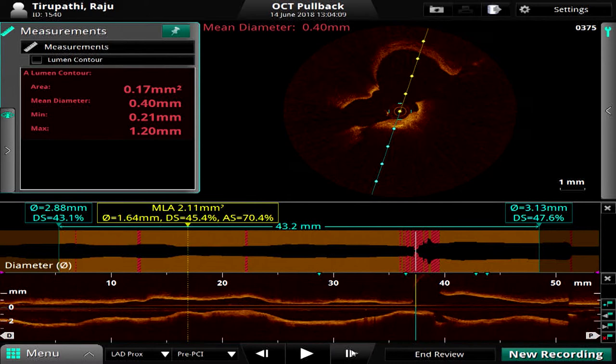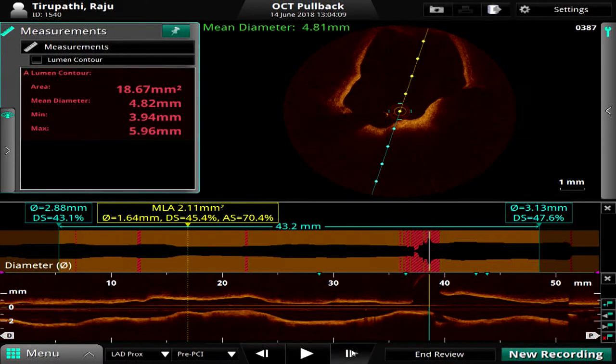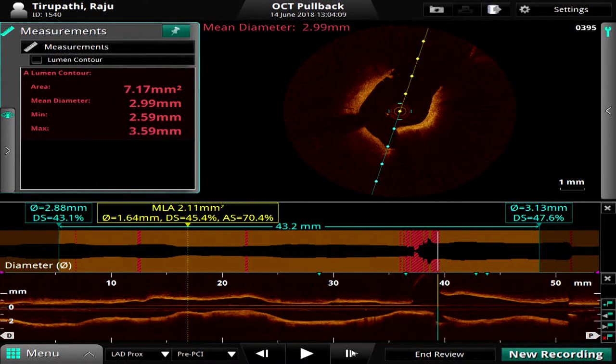Forward, please. And you can see in this view clearly the ostium of the left circumflex is free of any significant disease. Forward, please. At this point, you can see there is a discontinuation in the intima with appearance of a cavity, although it's not completely convincing for acute plaque rupture or any thrombus formation, but this raised the suspicion whether he had any plaque rupture at some point in the past, which is not quite clear. But what we know for sure is there is a discontinuation of the intima and there is a cavity formation, and that this lesion corresponds with the angiographic appearance of haziness on ostial LAD.